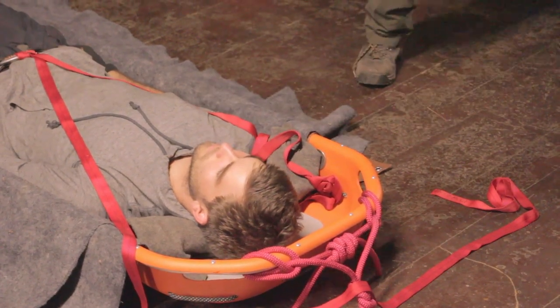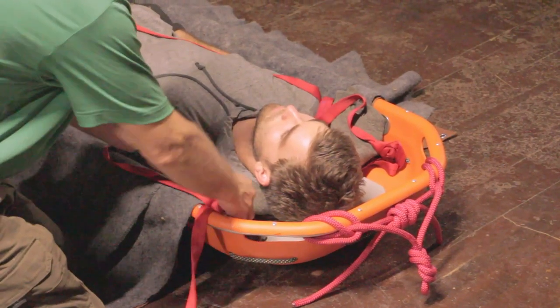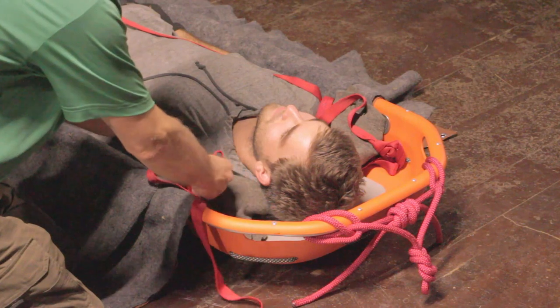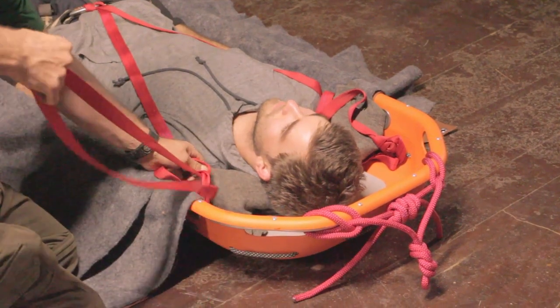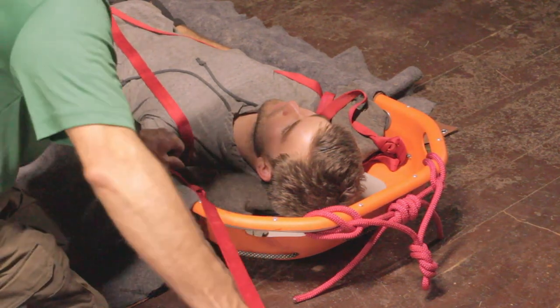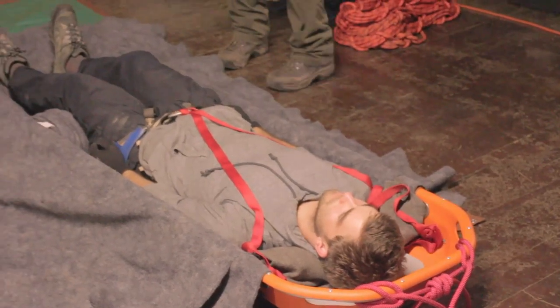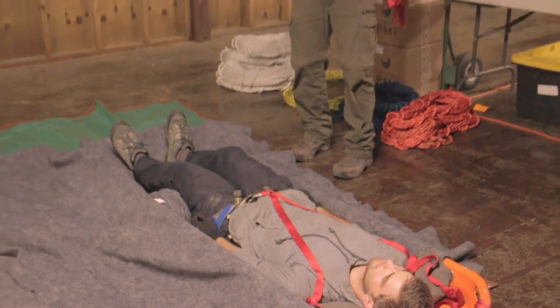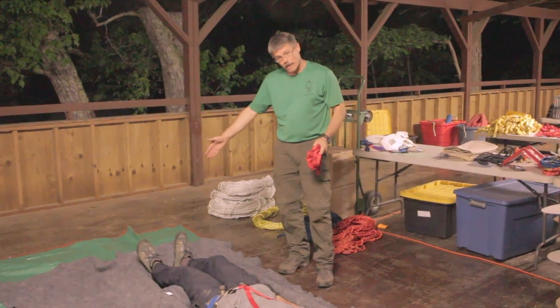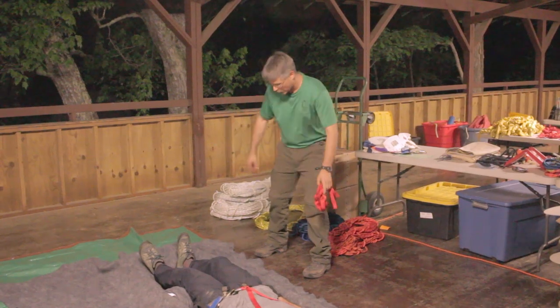We're going to do the other side quickly — no twists, a couple inches of slack, being careful not to slap my patient in the face with the tail of the webbing. Three half hitches snug against the lashing point, and tuck in the tail. We now need to secure our patient so that they can't possibly slide out the head end of the litter, which means we have to attach another double V. The problem is we can't get to any of our lashing points right now, so we need to do a little bit of folding of our packaging to get access to those lower lashing points.